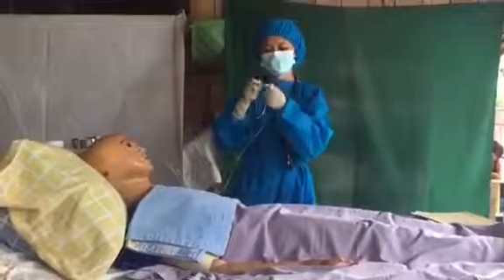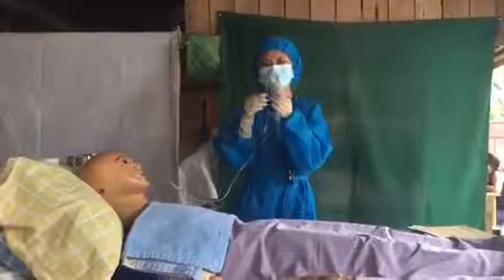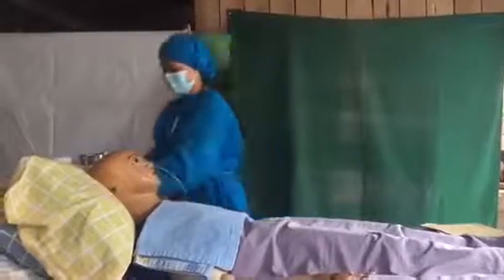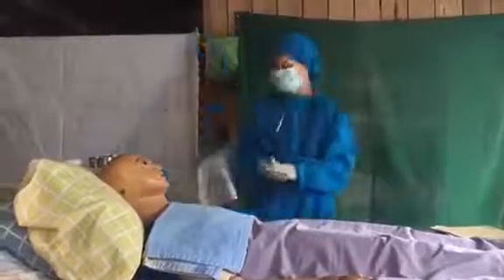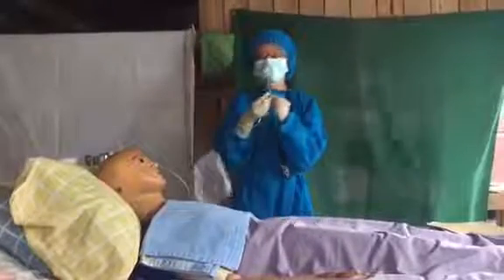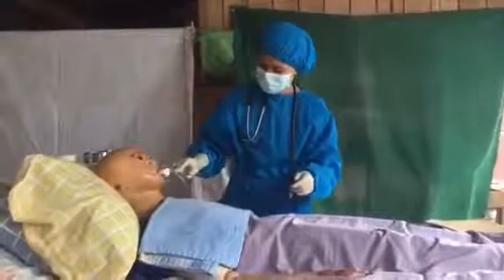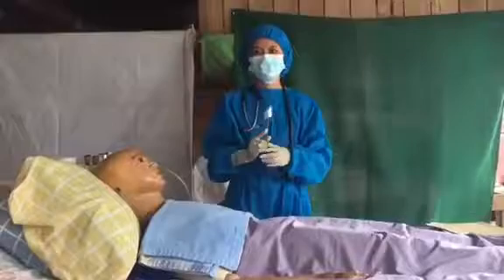So make sure to lock the tube to avoid unnecessary air. Okay, so put the tube behind the pillow and get the forceps with a cotton ball and clean around the mouth of the patient. So done.